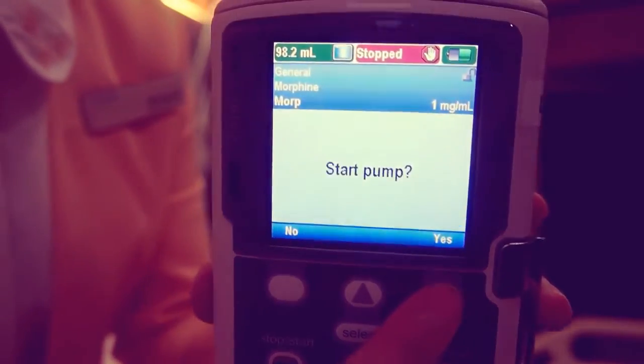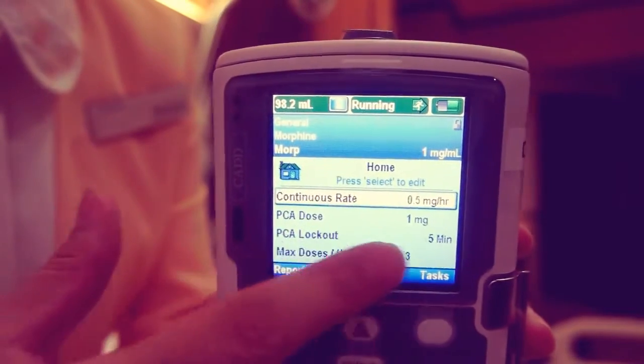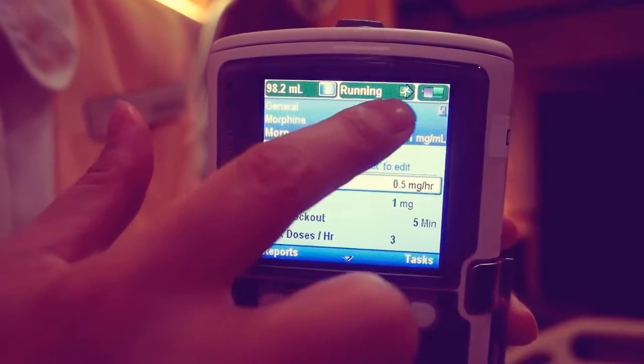Note that if a security code was used to unlock the keypad, the keypad automatically re-locks when the pump is restarted.